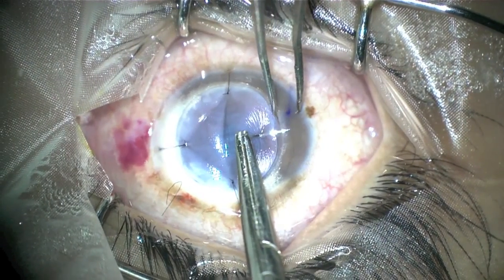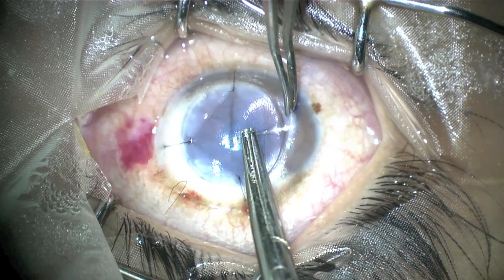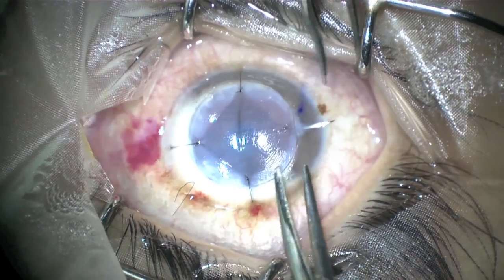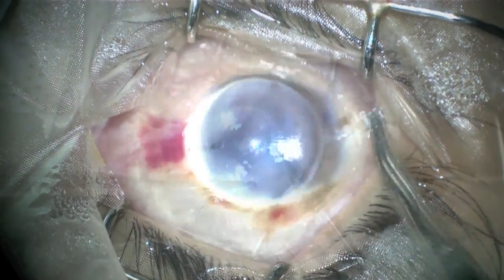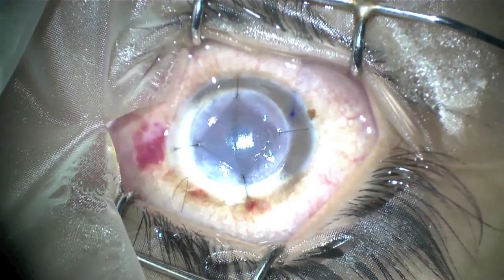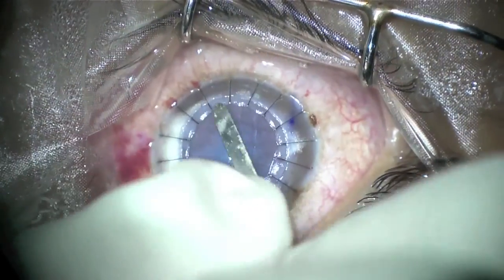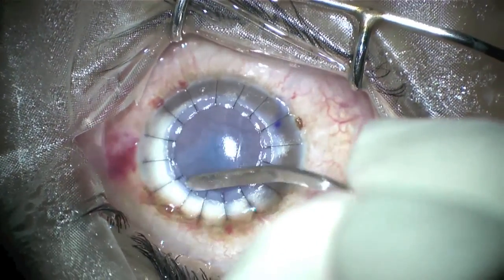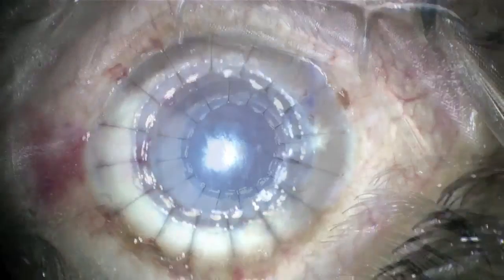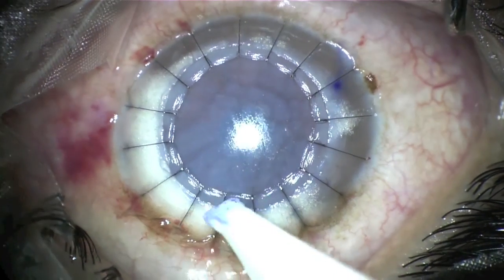The cardinal sutures are completed such that the graft is equally distributed, which is confirmed with the formation of a diamond. The rest of the sutures are completed. The graft is tucked in. The graft host junction is checked for any leaks.